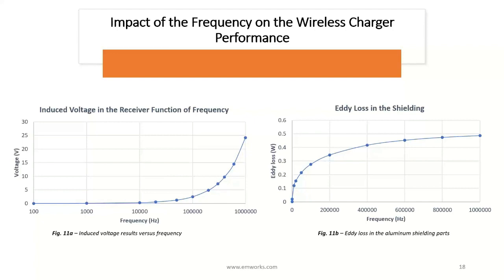But on the other hand, higher eddy current losses will be generated in the shielding components, which means we will need more power because the efficiency will be reduced. As can be seen, the eddy current losses shown in figure 11b are increasing versus frequency. So let's suppose that we can remove the shielding components. Another limitation of using very high frequency in wireless rechargeable and implantable devices is related to the high risk of electromagnetic radiation in the human body. We will be studying this at the end of this presentation.